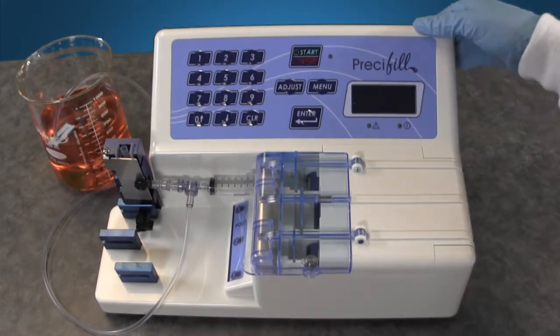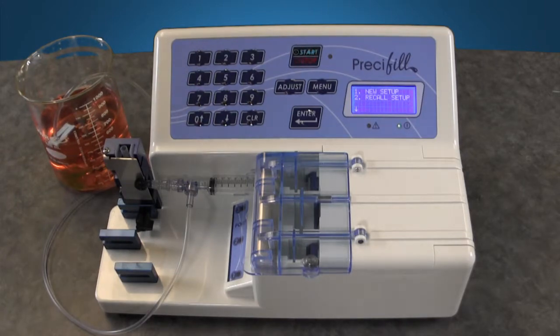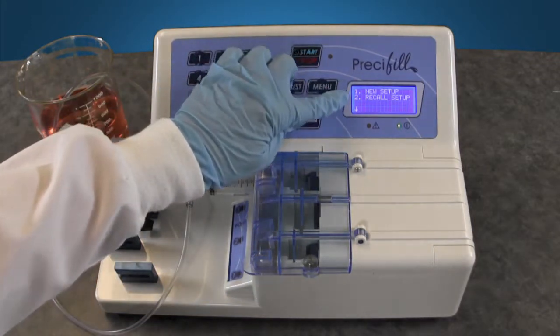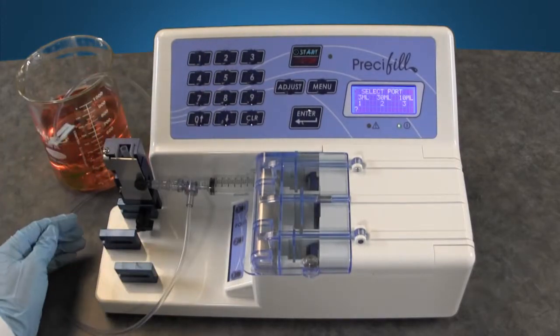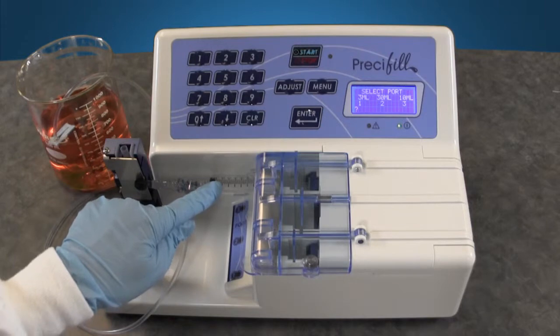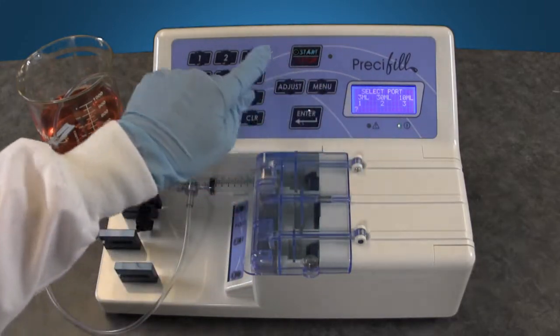Turn on the pump using the on-off switch at the back. The software screen will light up. You can begin programming the pump following the display screen prompts. You will be able to select New Setup or Recall Setup. Press 1 on the numerical keypad. Select your port. We are using a 10 mil syringe which reflects port 3. Press 3 and enter.